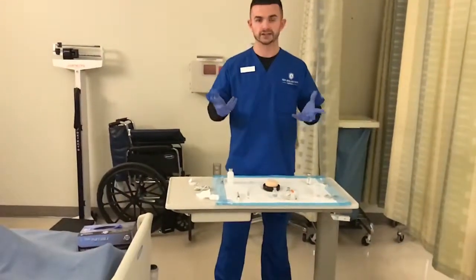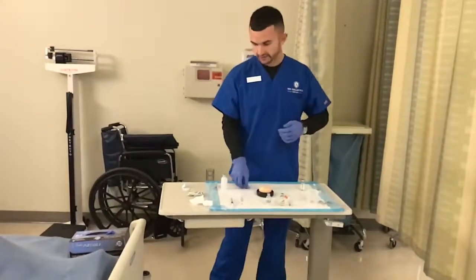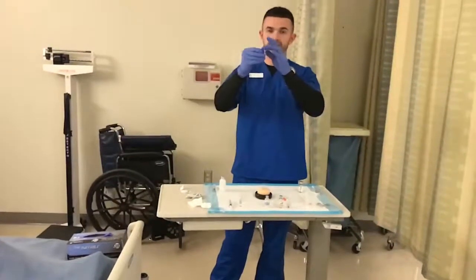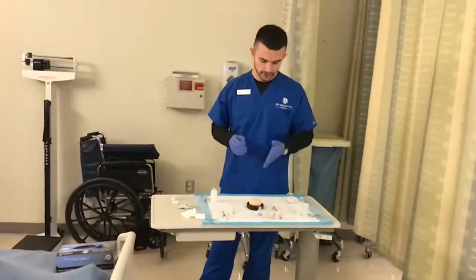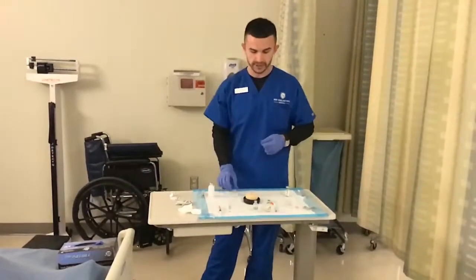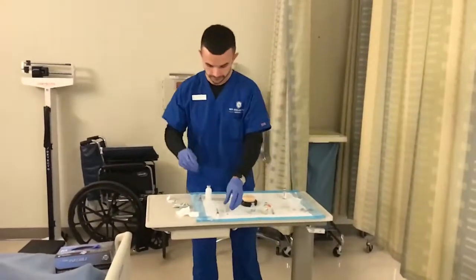And before I broke it, I skipped a step. You would take the vial and you would mix it, because the medication sits on the top. So you want that medication coming to mix down, or you can roll it between your hands. You can also roll the insulin medication between your hands too if you want to mix that up.